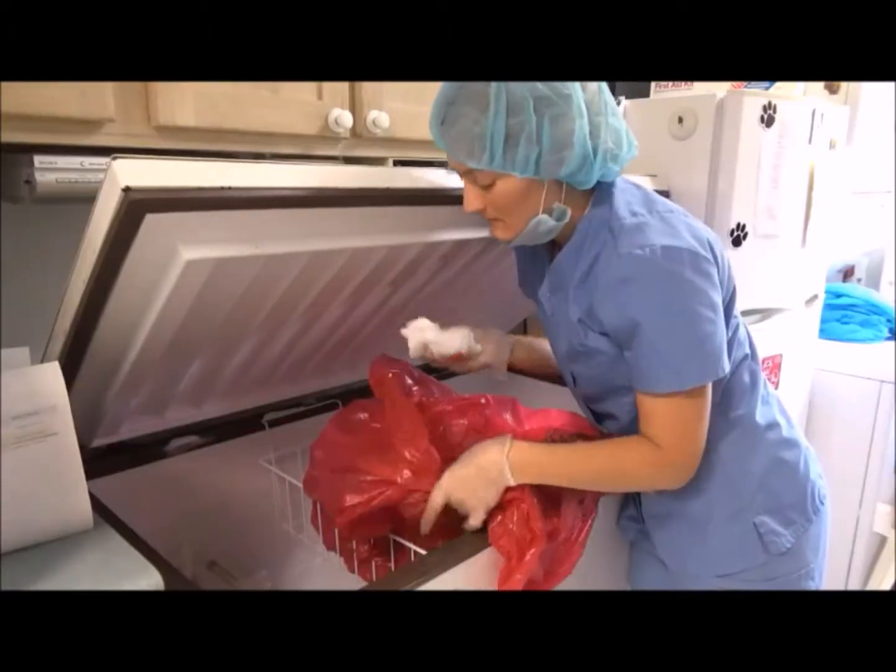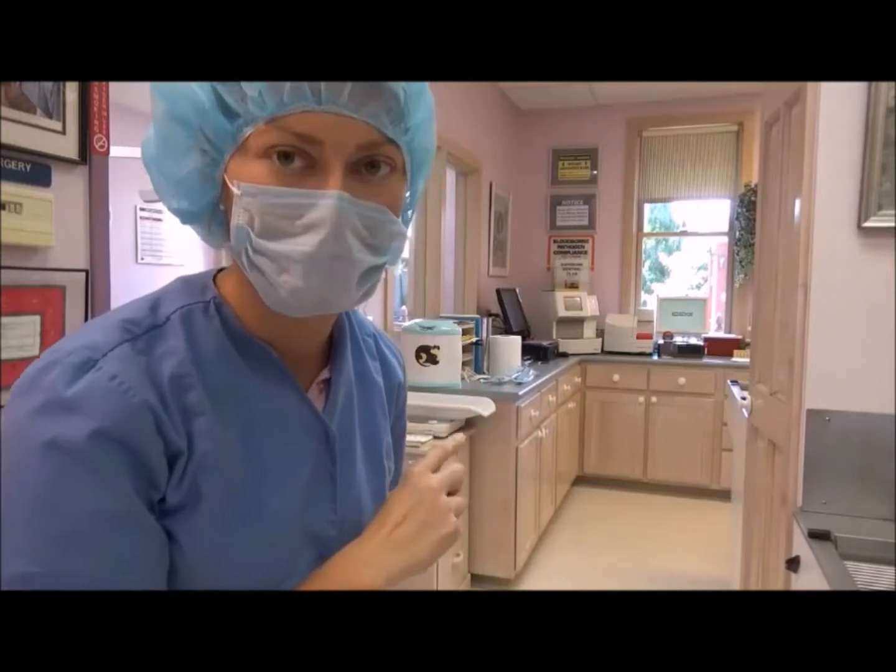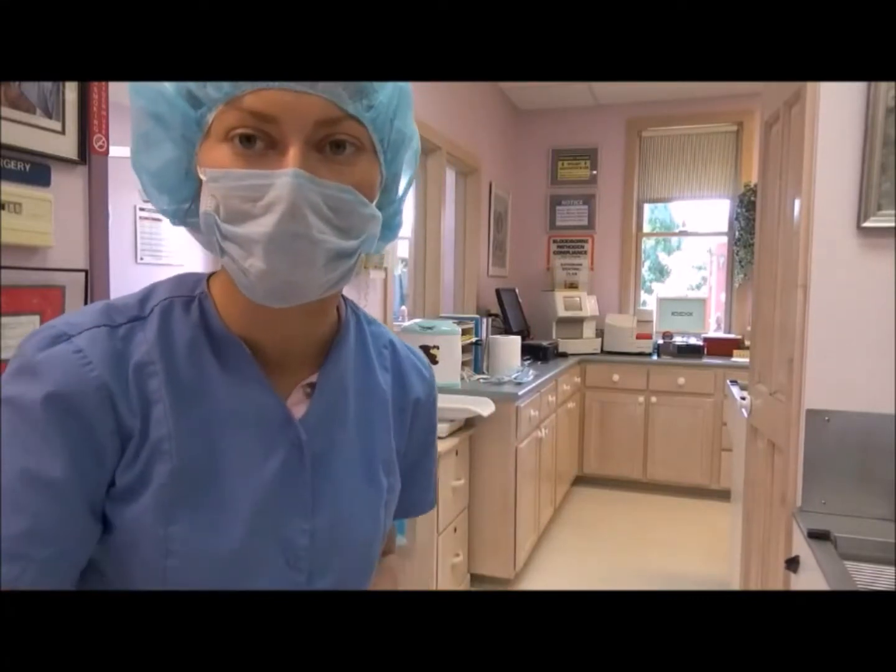Now I'm going to dispose of the testes in our red biohazardous waste bag. I'm going to go ahead and pre-soak our tools and decontaminate them.